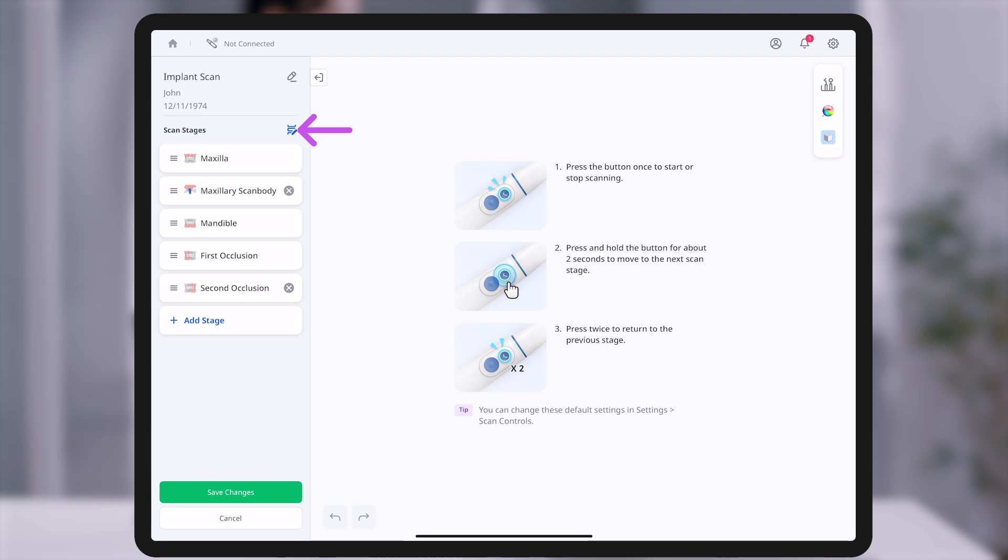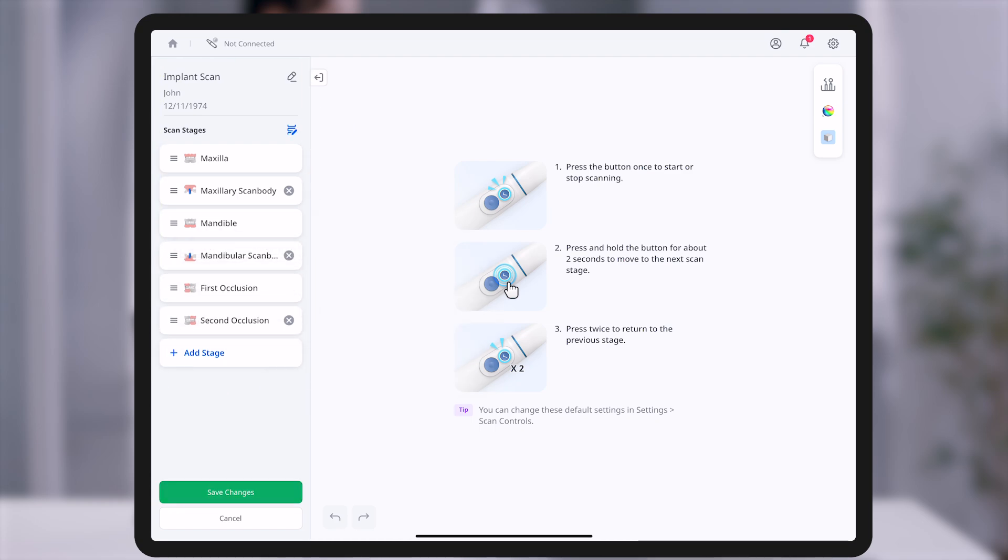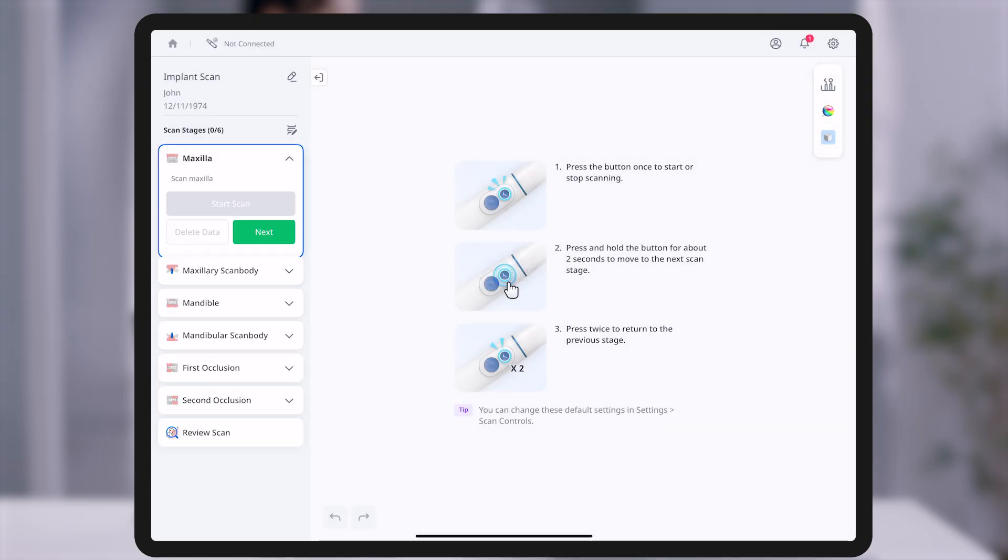Each workflow is automatically structured with appropriate scan stages, and users can add or adjust stages as needed.